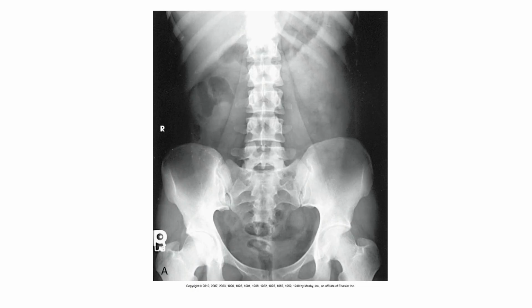It's about a half a degree of rotation, but it is some slight rotation here in this radiograph. Now, is it enough to repeat? No, it's not. But there is. So kudos to you. If you see that pelvis is slightly asymmetric, you have a good critical eye. Okay, so the width of the wing of the right pelvis is a little bit skinnier than the width of the wing of the left pelvis.